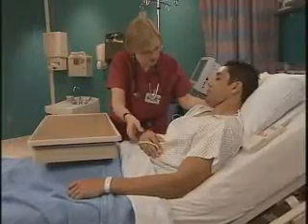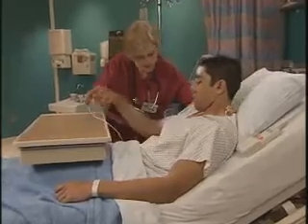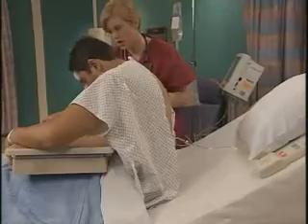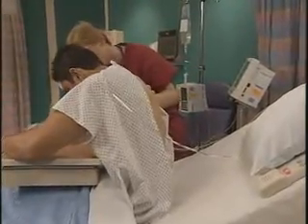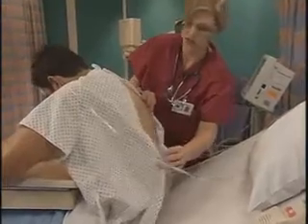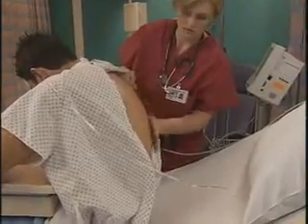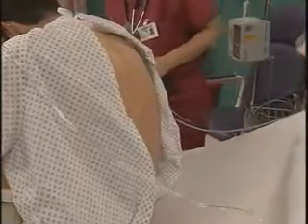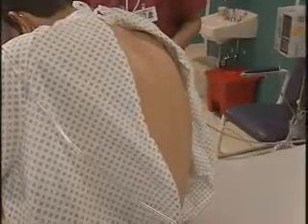Okay, and lean over this table. Help the patient into an appropriate position. If he can tolerate sitting upright, have him lean over a bedside table to accommodate a tube in the 4th or 5th intercostal space, usually lateral to the nipple line. Otherwise, help him into the lateral supine position with the affected side up.